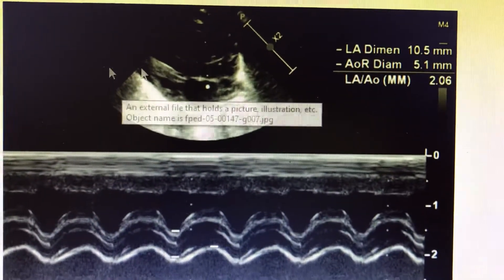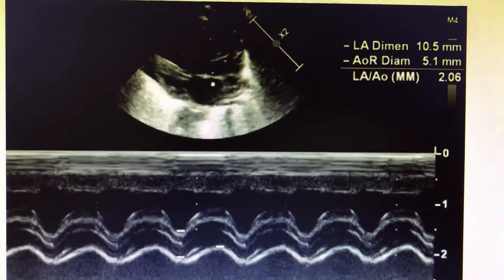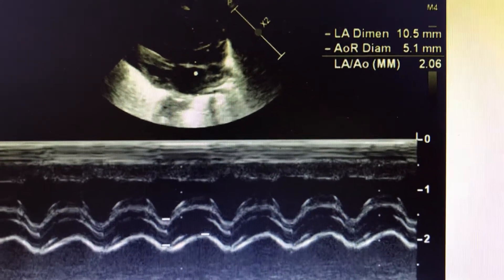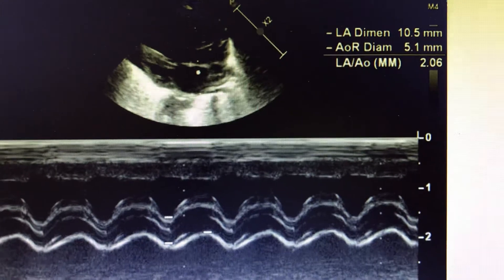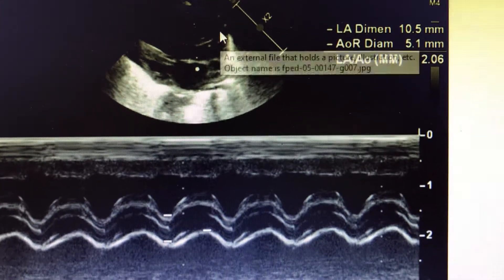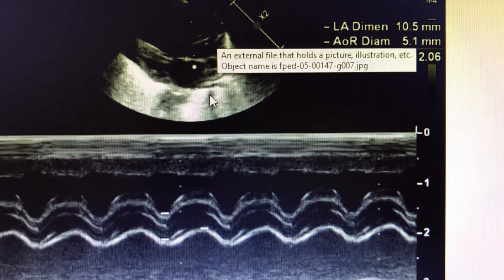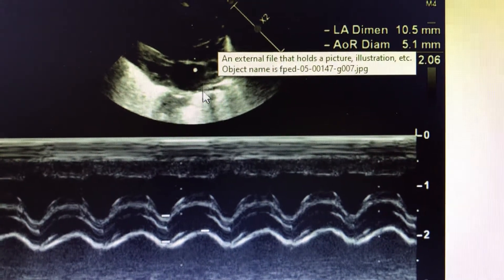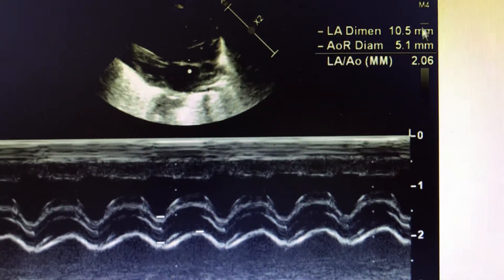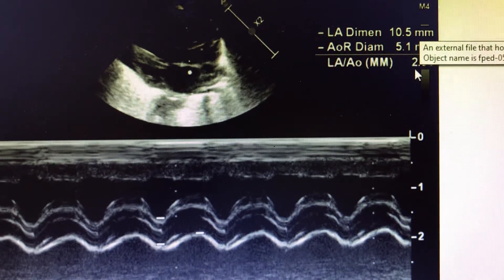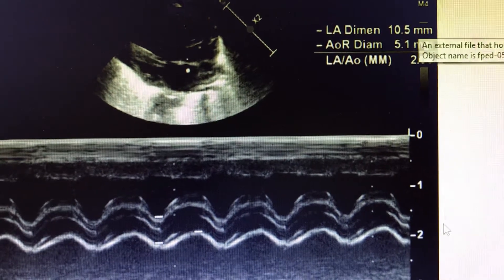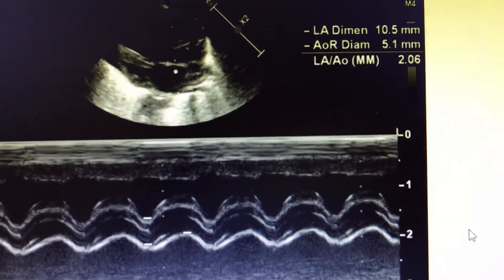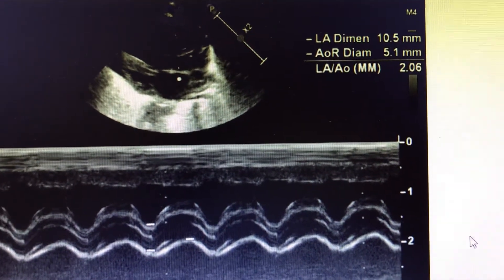We have already discussed the LA to Aorta dimension. It is usually taken in the parasternal long axis view using M-mode, with the cursor placed across the Aorta just distal to the sinuses of Valsalva and at the middle of the LA. You take the LA diameter and the Aortic root diameter, and the LA to Aorta ratio is calculated. If it is more than 1.5, you are most probably dealing with a dilated LA compared to the Aorta.